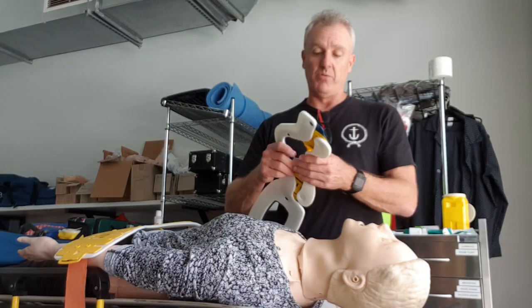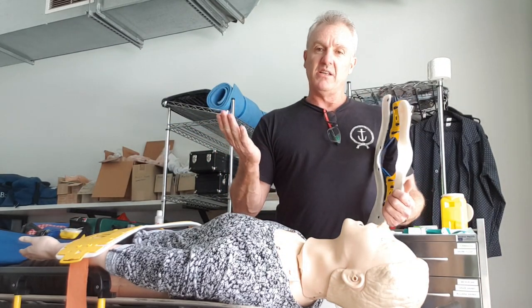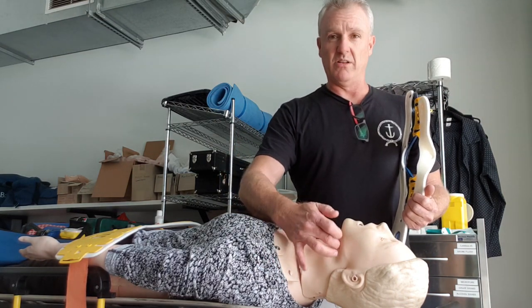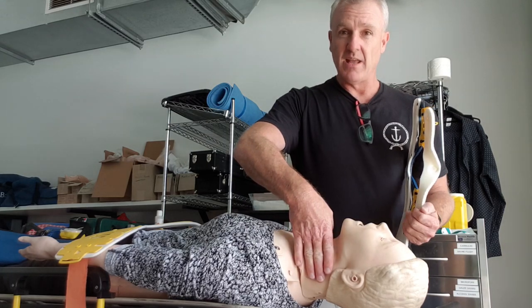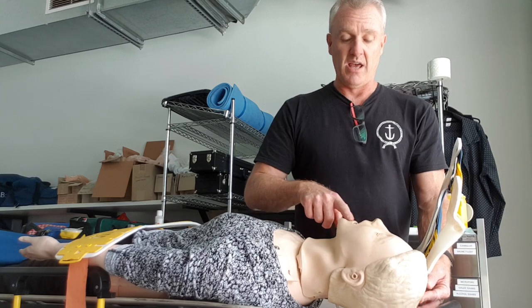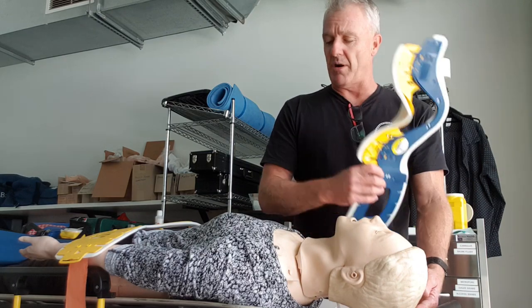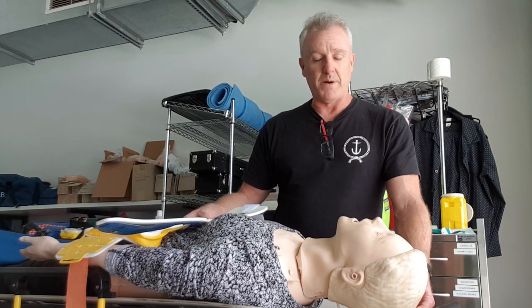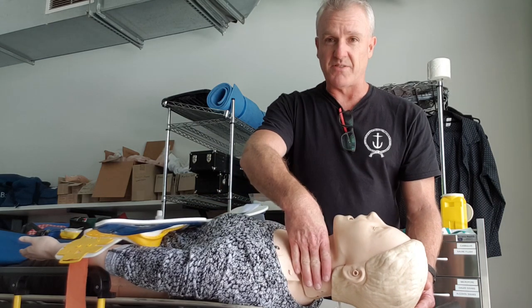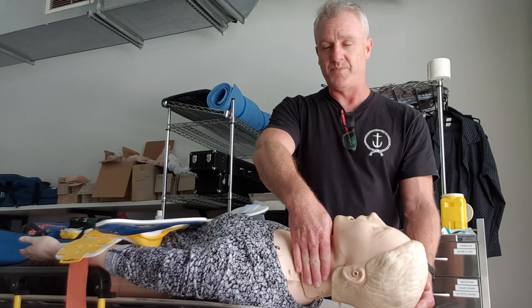Sizing is pretty much the same from version to version. It's the finger technique — top of the trap to the angle of the jaw. When you measure this, the patient's head should be in neutral; it shouldn't be hyperflexed, it shouldn't be hyperextended. The patient's head would probably be supported by a second officer or your partner, and the head would be in neutral. So measuring from the top of the trap along the angle of the jaw, as you can see there, that's probably four of my fingers.